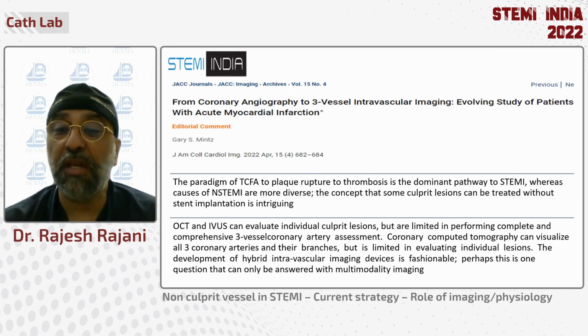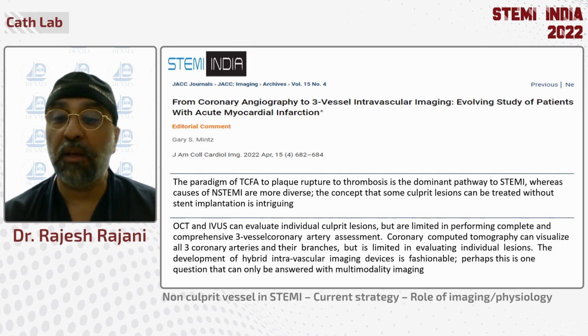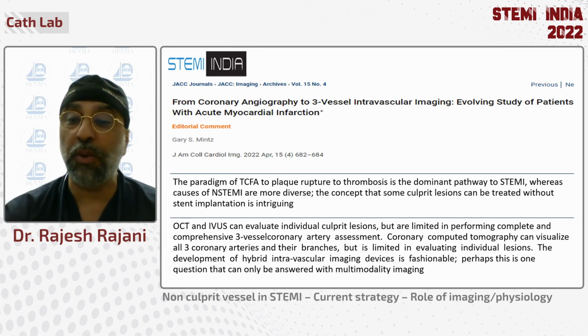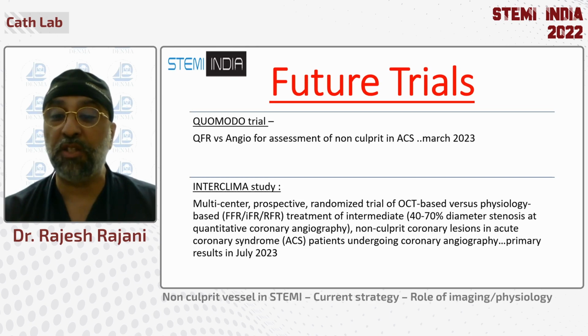So we basically have other modalities, like coronary computed tomography, which can visualize all the 3 coronary arteries and the branches, but is limited in evaluating the patients undergoing this particular procedure.